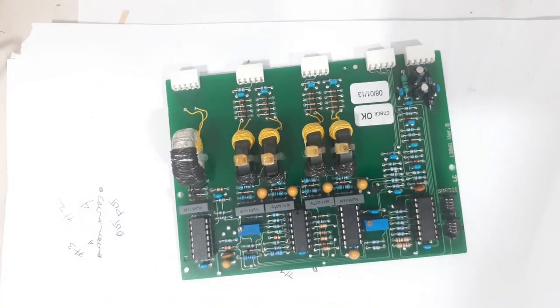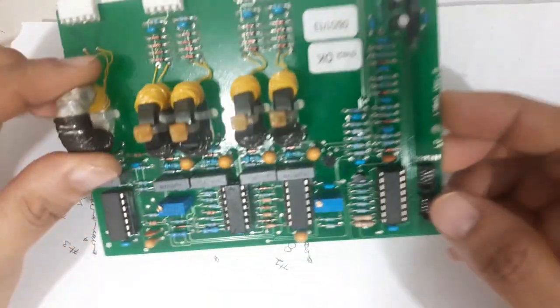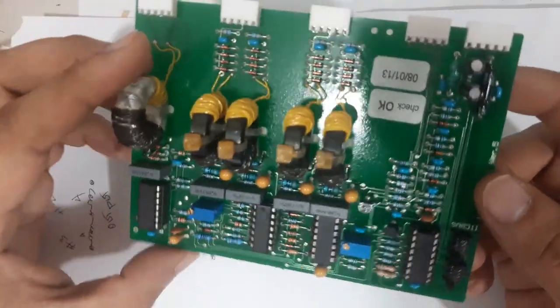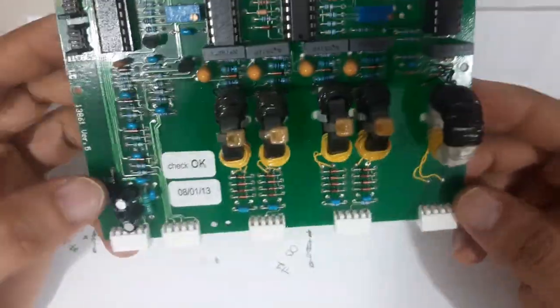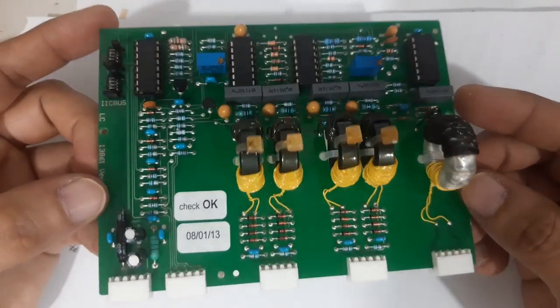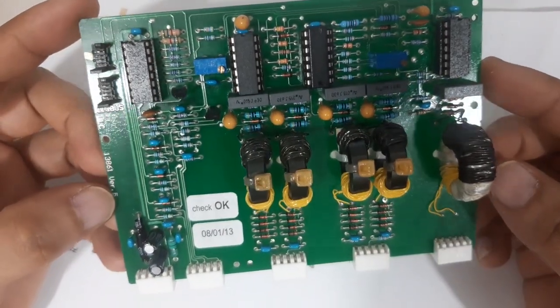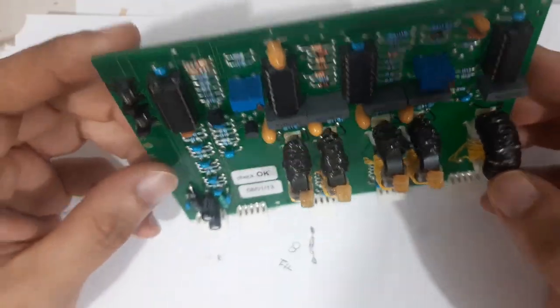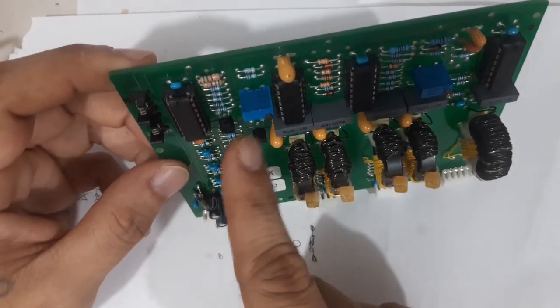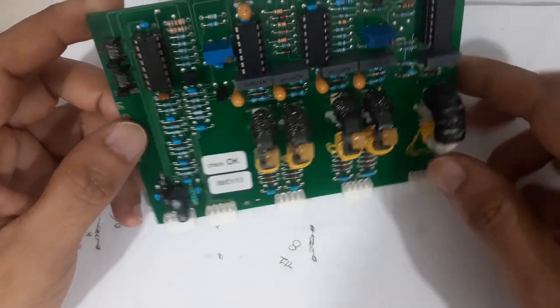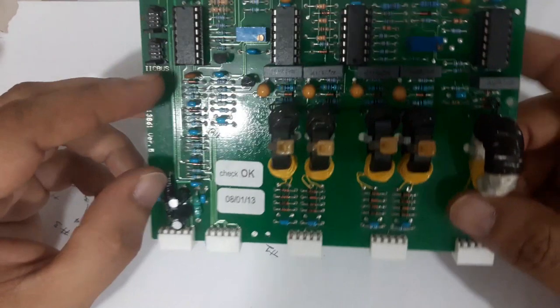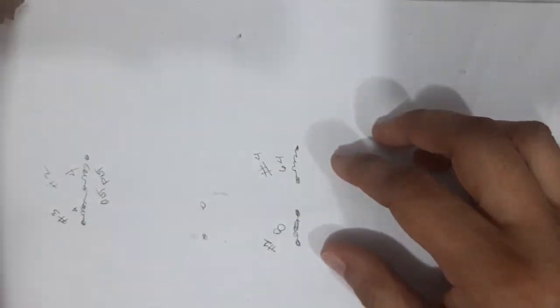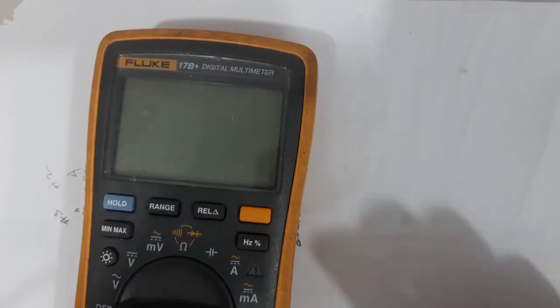Usually the problem with these boards are short components, maybe transistors or the diodes here, so we will check that. But before we start, let me show you one thing.